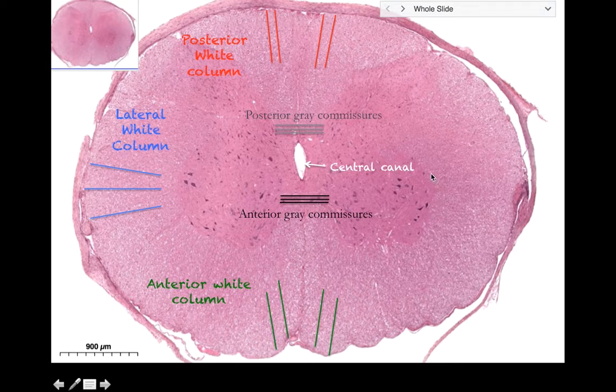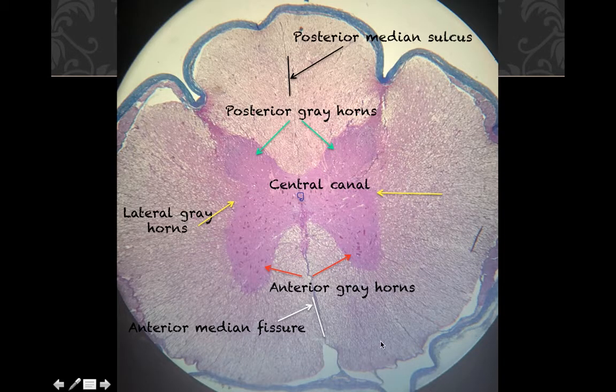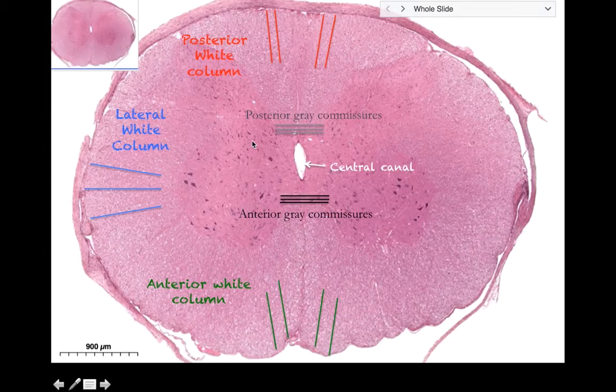It's large. Okay, so then in the white matter, you have these tracts, because this is all central nervous system. This is composed of tracts, aka axons, of the dendrites and cell bodies that exist here. So these are the axons of those neurons. They make little lines. You can't see it very well on this slide, but you can see the lines here. The lines going in, you see the tracts all going towards that gray matter.